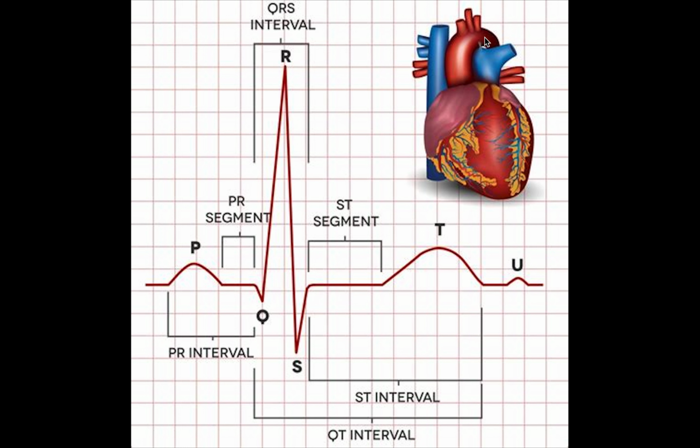And it goes through this big arched thing that we call the aorta, with the little smokestacks here, which go to your carotid arteries and subclavian arteries. So what are these squiggles? Well, we need electricity to make these muscles contract, okay? The muscles of the heart. So we can actually measure the voltage.